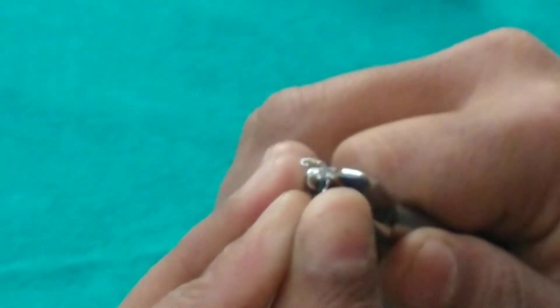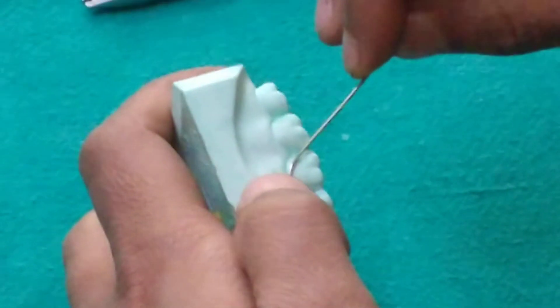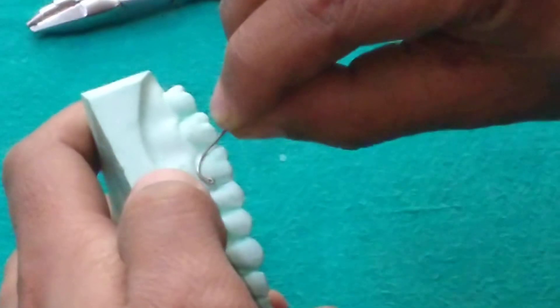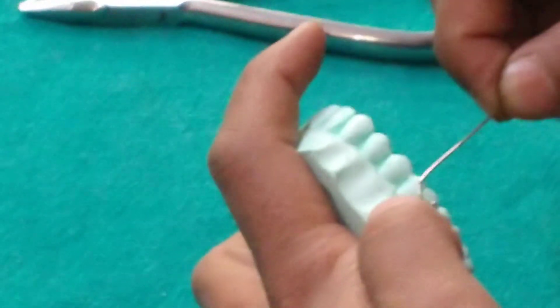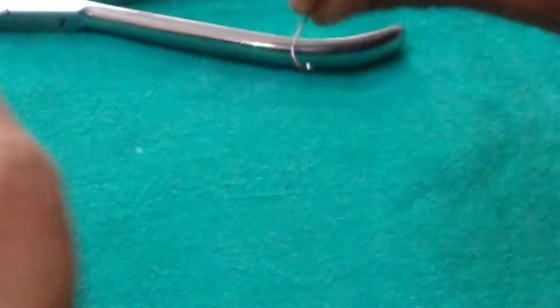We are bending the C curve. One margin will engage the distal proximal undercut. The curve has to be smooth with gradual walking of the plier along the wire, adapting the wire below the buccal cervical undercut.